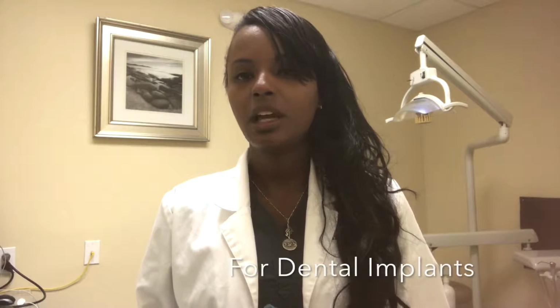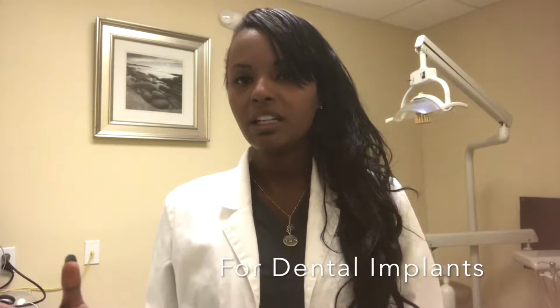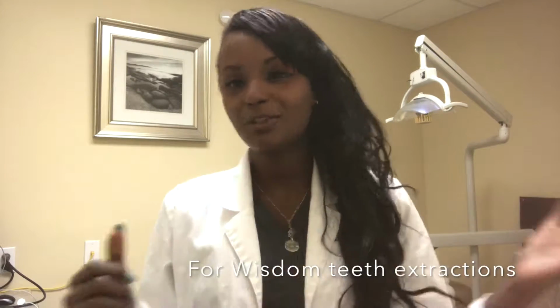So in a traditional x-ray, what you see is 2 dimensions. That means up and down and this way. But with a 3D image, we're able to see things in 3 dimensions in which I can rotate and see that in all different angles. So I'm going to show you what one of those images look like today so you can get a better idea of how dentistry and 3D imaging looks like.